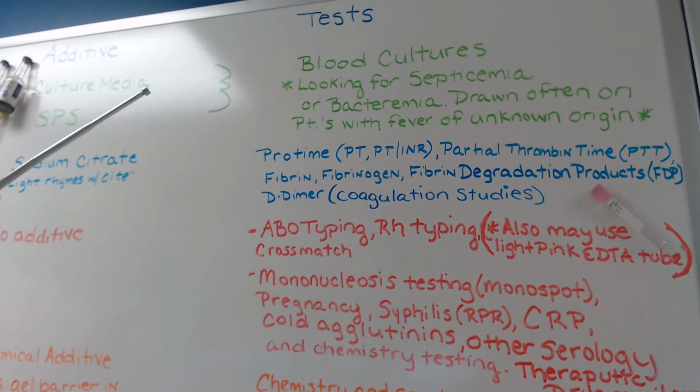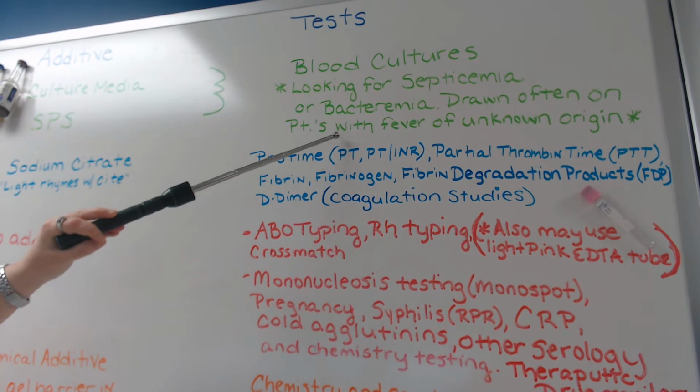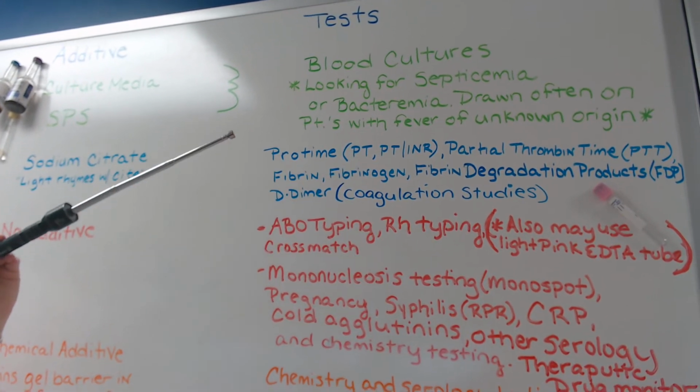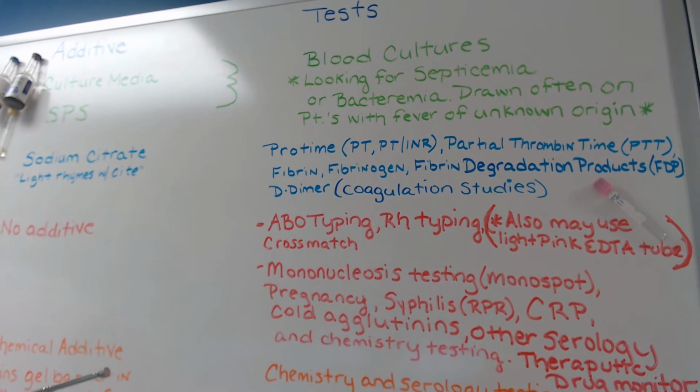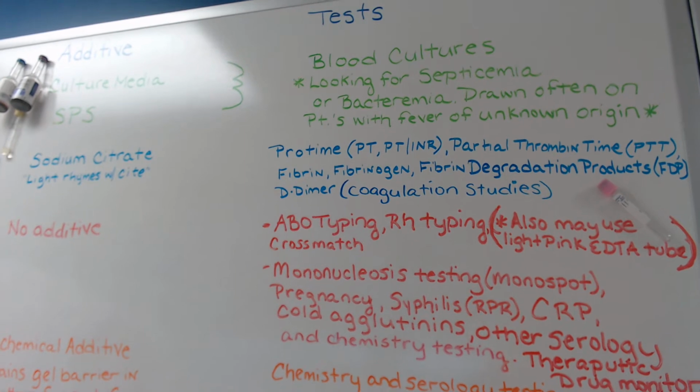blood. Generally with patients that have a fever of unknown origin, those are patients that we definitely will run these tests on to try to figure out what's going on with them that we can't figure out any other way that we've tried so far.